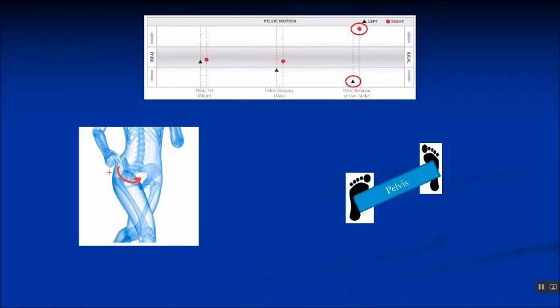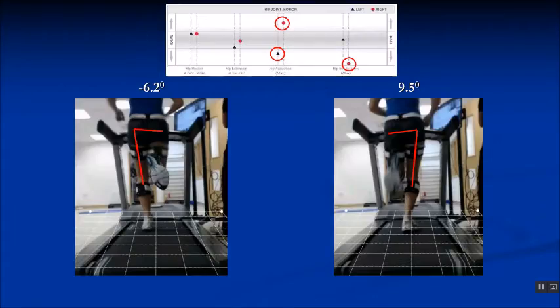Looking at her particular values, what's notable at the pelvis is the asymmetry and in particular the excessive right-sided pelvic rotation at foot strike. When we look at the hip, because there is high pelvic rotation we have low hip rotation, but you'll note there is excessive hip adduction on the right side and if anything it's restricted on the left.